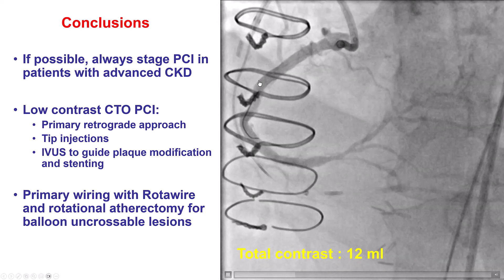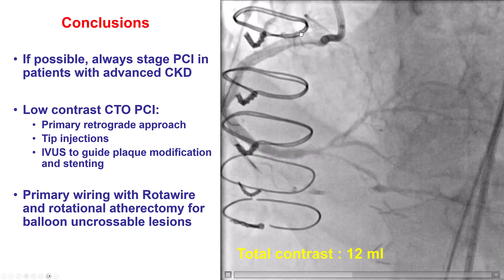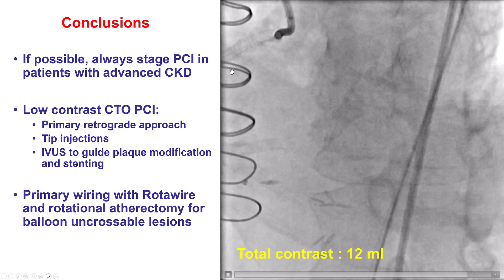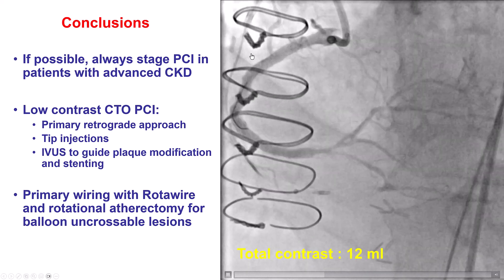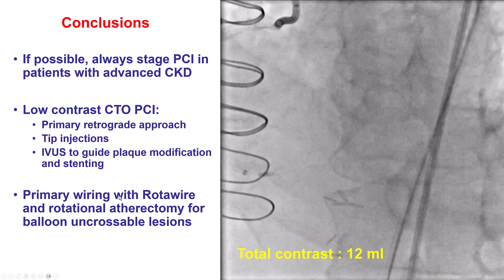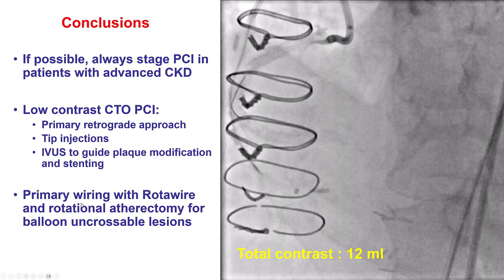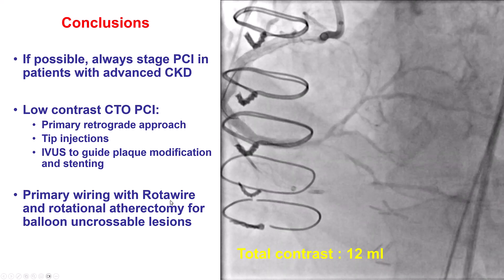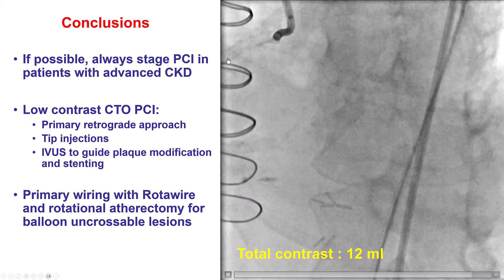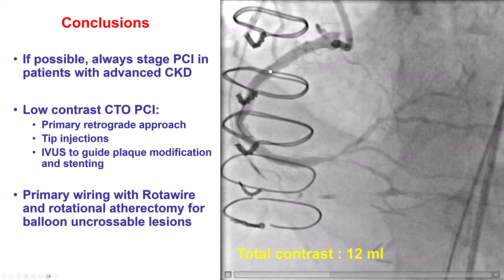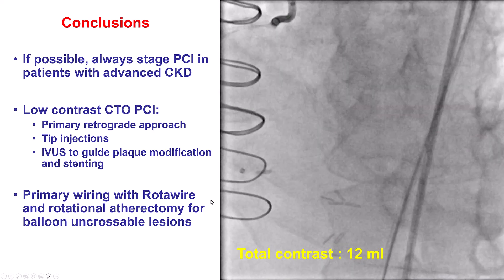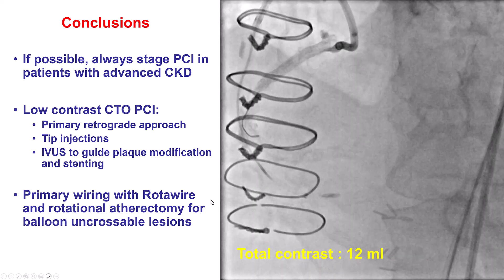Another difficulty in this case was the inability to advance microcatheters through the heavily calcified mid-right coronary artery. This was addressed by advancing a Rotawire and performing rotational atherectomy in the mid-RCA and subsequently in the distal RCA as well. Thank you.